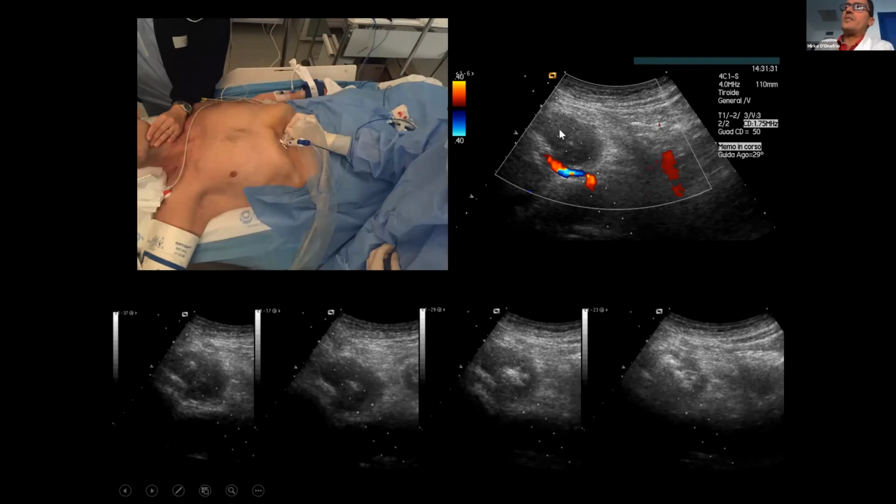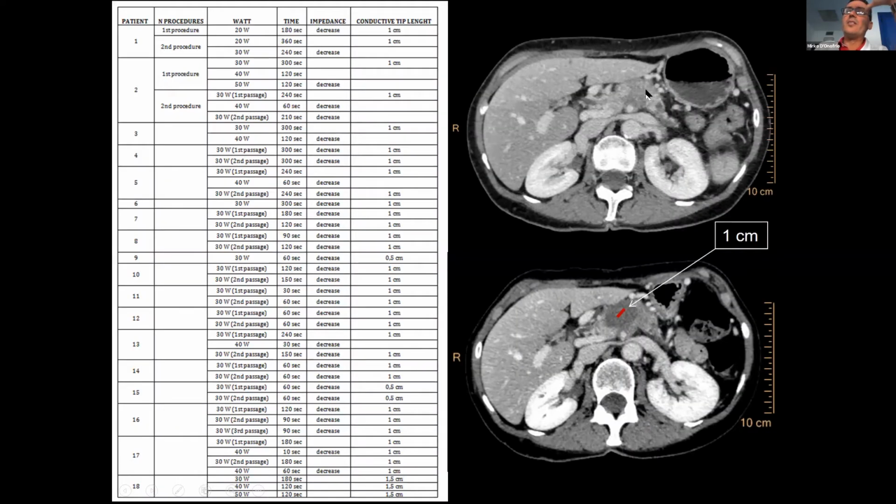And so this is an example of an ablation. Ablation performed percutaneously is a thermoablation. And as you can see, the technique is nowadays well known. We have to put the needle perfectly inside the ductal adenocarcinoma. This means that we will do only a cytoreduction, with respect to the liver. But you can see the gas developing, and very often the ablation will cover the lesion quite completely, but from the inner portion, from inside the lesion.